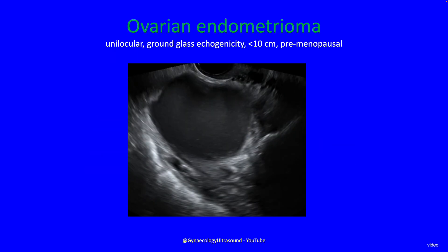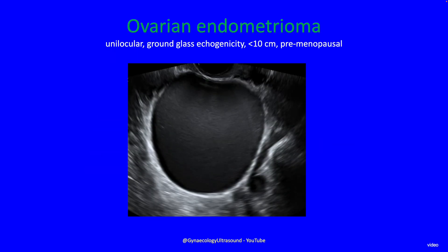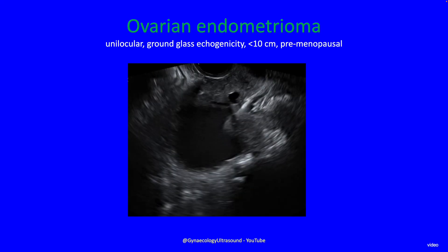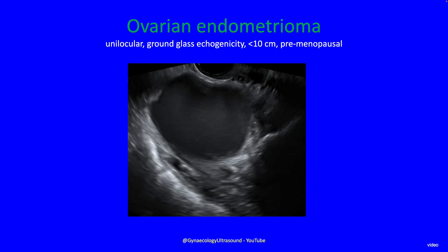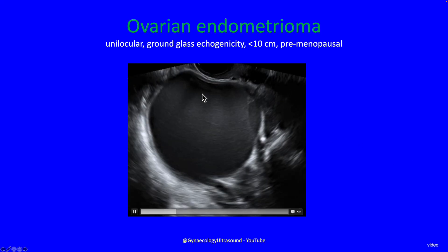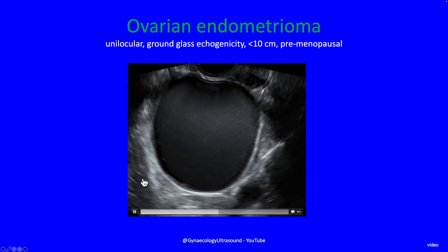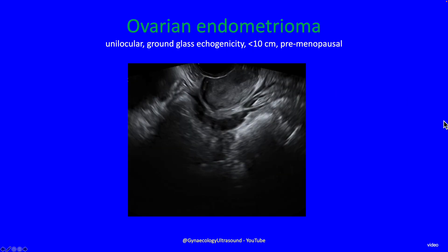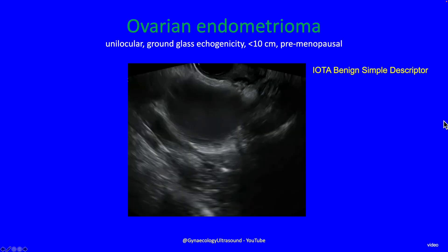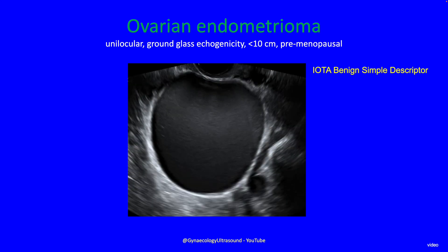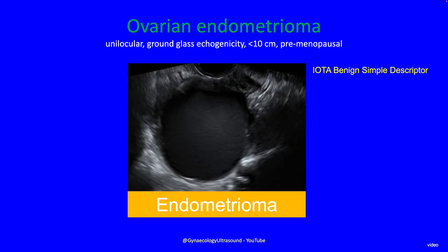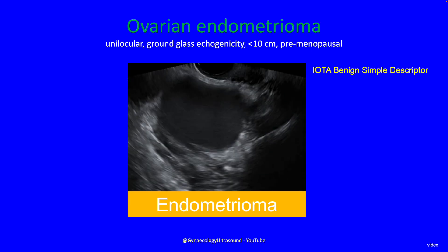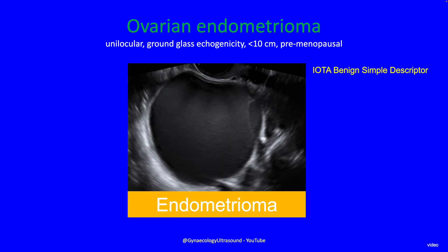This is an example of such an ovarian endometrioma. You can see it's unilocular — there's one locule, no solid component, the echogenicity is ground glass, it's less than 10 centimetres in a pre-menopausal woman. It's so obviously an endometrioma that this has become an IOTA benign simple descriptor — something you recognise immediately when you see it.